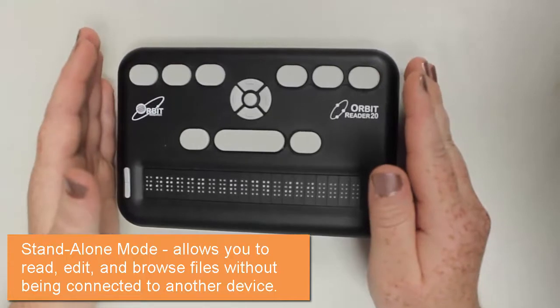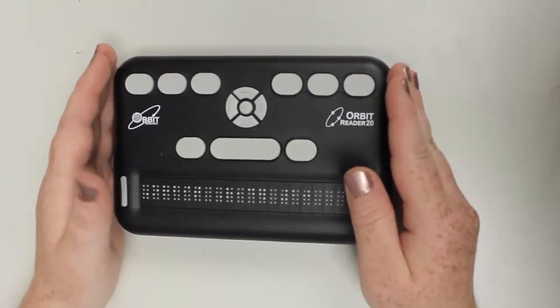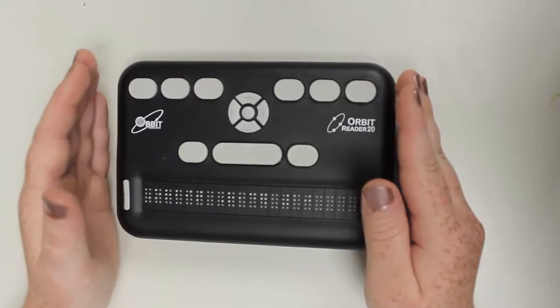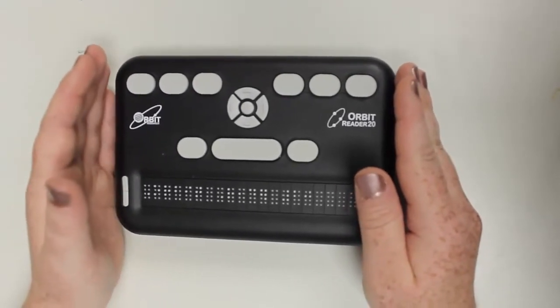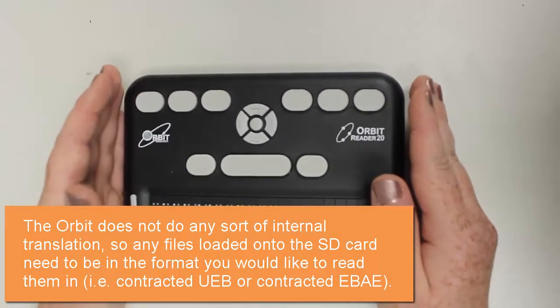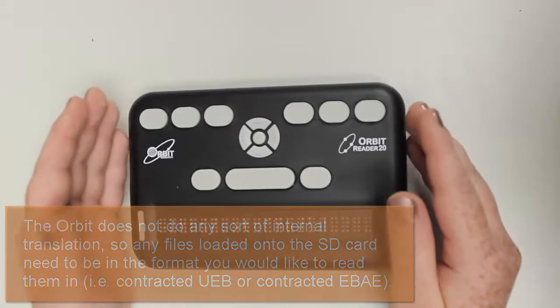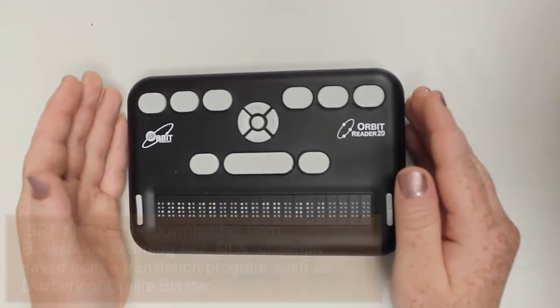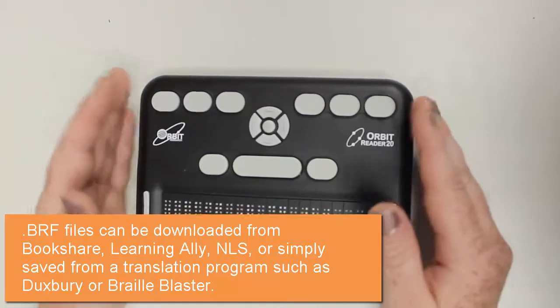Standalone mode is the mode that you can read BRF files that are downloaded from various sources like Bookshare, National Library Service, or anything that you create in Duxbury and is saved as a BRF file. You can get BRF files from Bookshare, Learning Ally, all of those things.